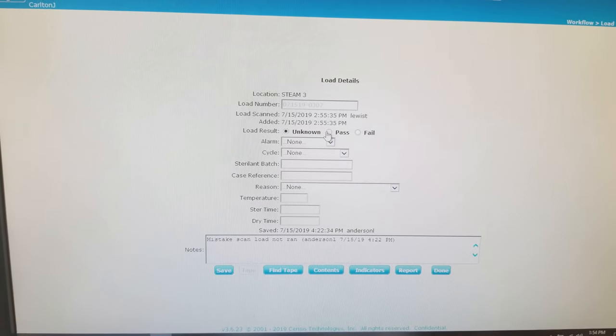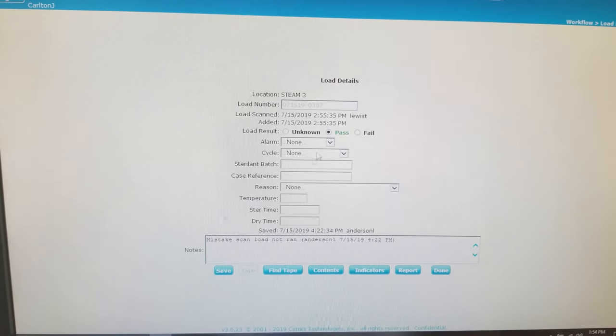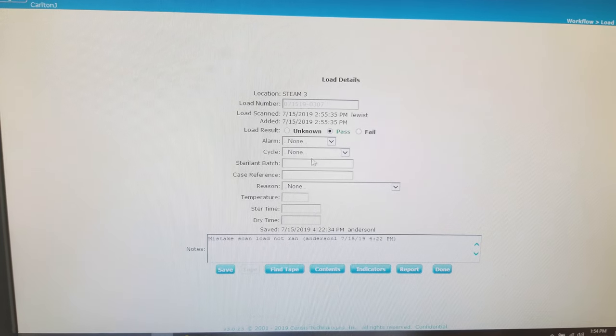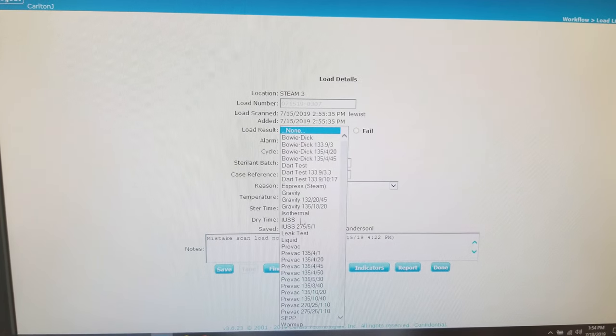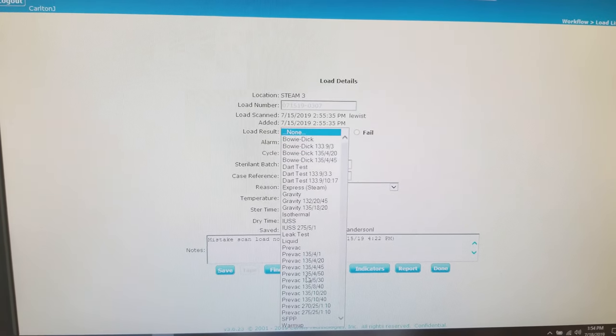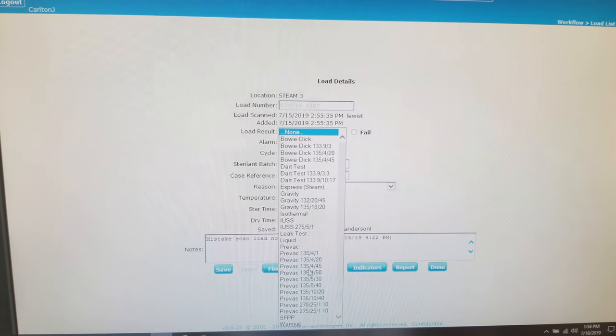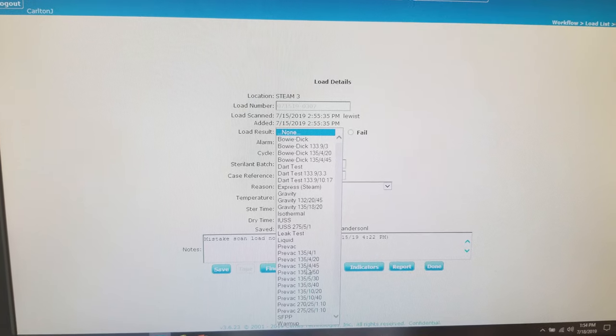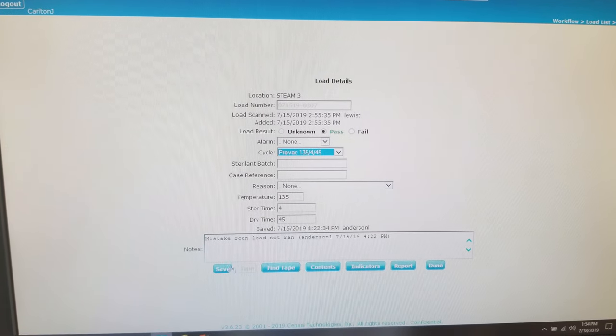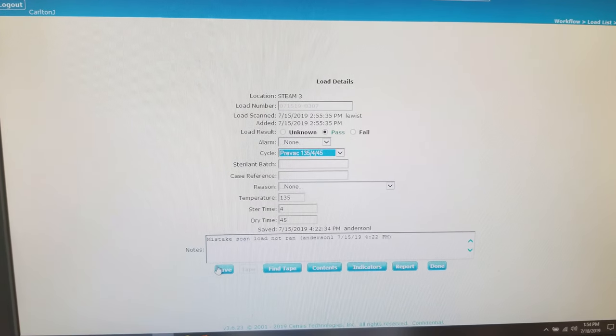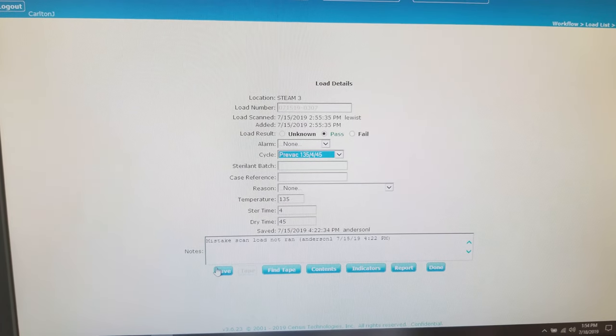First, you want to go to the load result, click pass or fail. Then you want to go to the cycle and select the cycle that applies to your load, PreVAC 4 and 45.